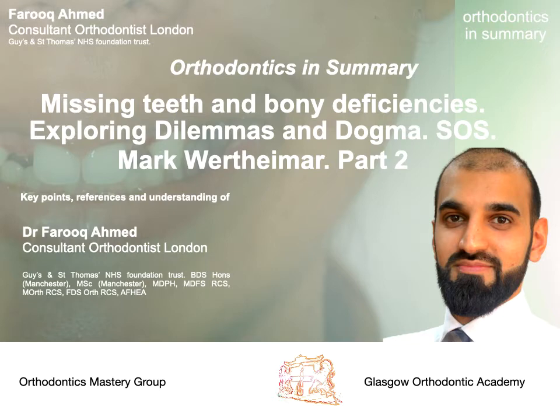So, the way that we can achieve this camouflage process of moving the canine's gingiva more incisal or more inferior is through bracket positioning. If the bracket is positioned higher up on the tooth, more gingival, it allows the canine to be extruded as the leveling takes place. That extrusion process brings the gingiva with it, and therefore we have a nice step between the central incisor and our canine camouflaged as the lateral incisor.